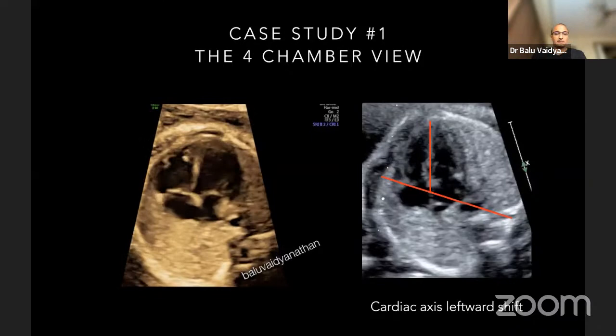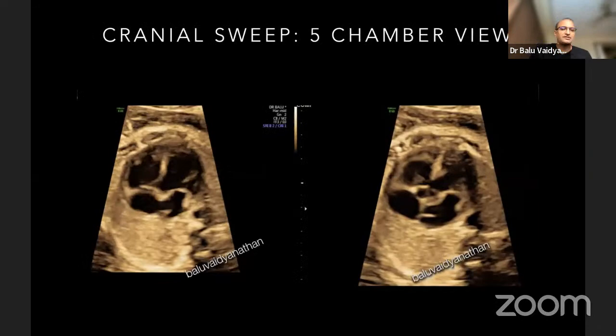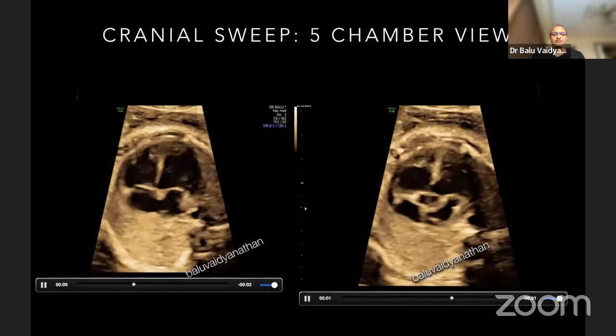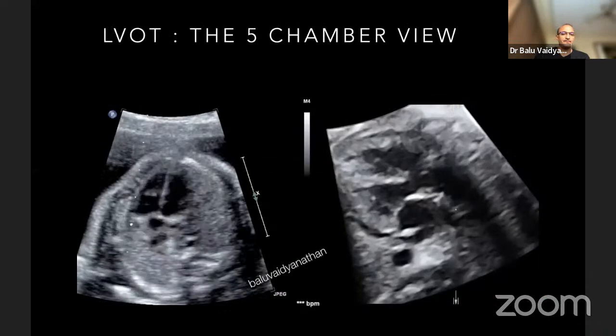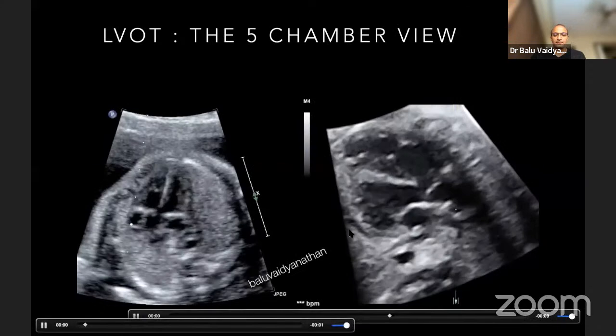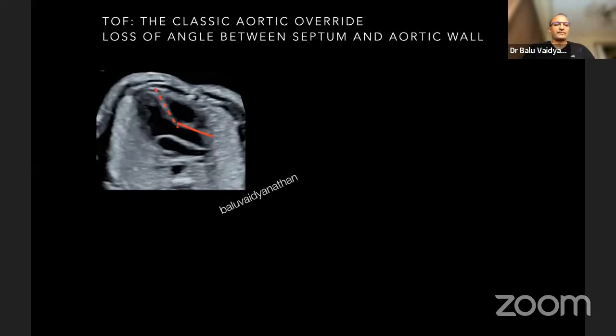This leftward shift gives you a clue that this is not normal. Next, when you sweep towards the five chamber view or the LVOT view, the VSD becomes very obvious. There is an overriding vessel which in this case was traced as the aorta. So we have a VSD with an overriding aorta. That aorta is very, very clear. In both views there is a VSD with an overriding aorta in the five chamber view. In a normal heart, you have septo-aortic continuity.